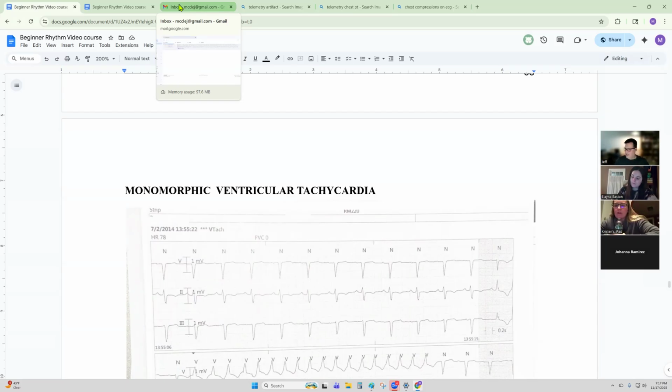So we did all the basic stuff, and I wanted to start to include some, it's not next level stuff, but really kind of noteworthy things. Like there's more to sinus than just the old classic things. I'm just trying to have words here while I figure this out.